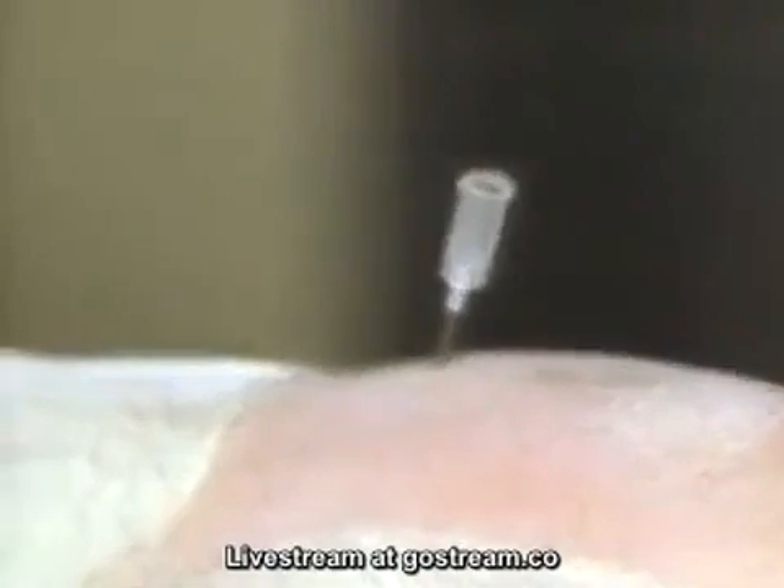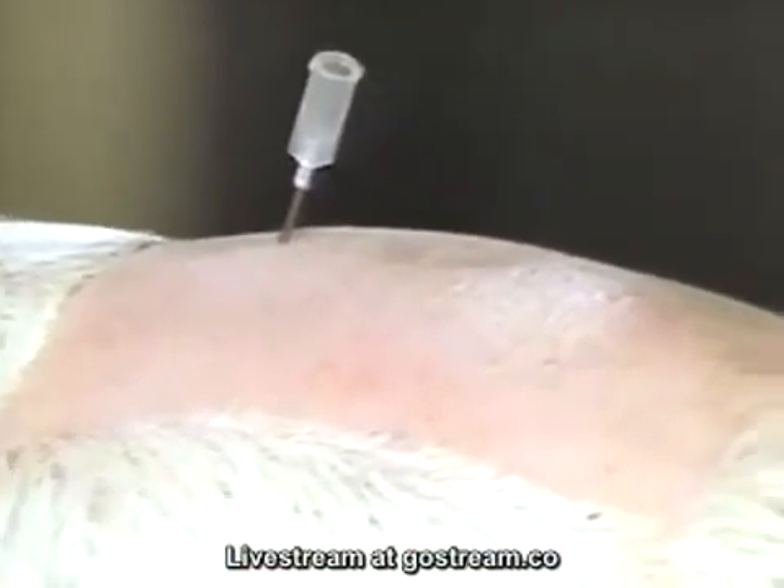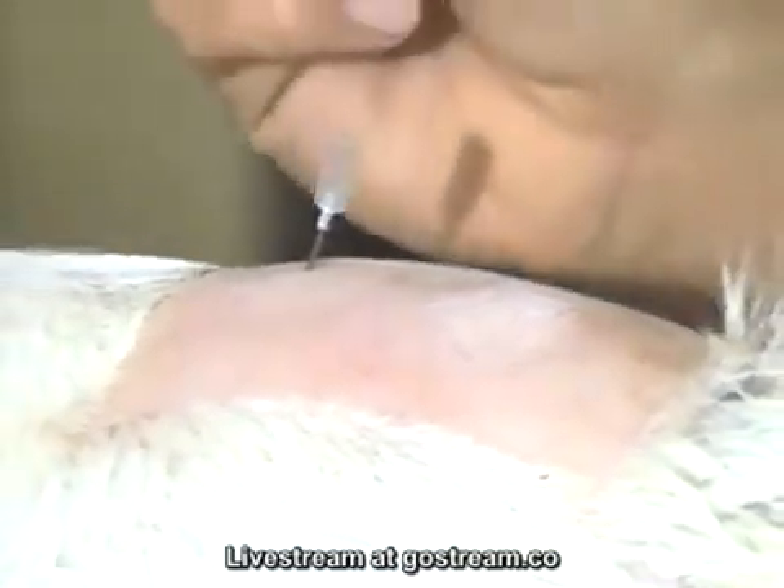If you have some question about the disposition of the animal, it would be best to stand off to the side or in a frontward position so that she doesn't kick you.